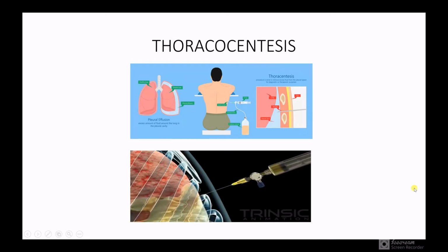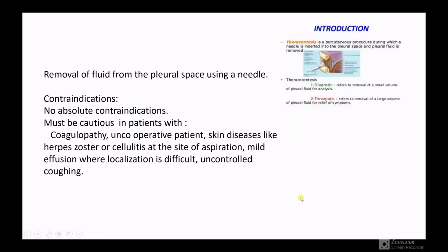You can see how the blood fluids are being taken out. Now, next going to the introduction. Let me tell you what thoracocentesis is. As you know, it's the removal of fluid from the pleural space using a needle.